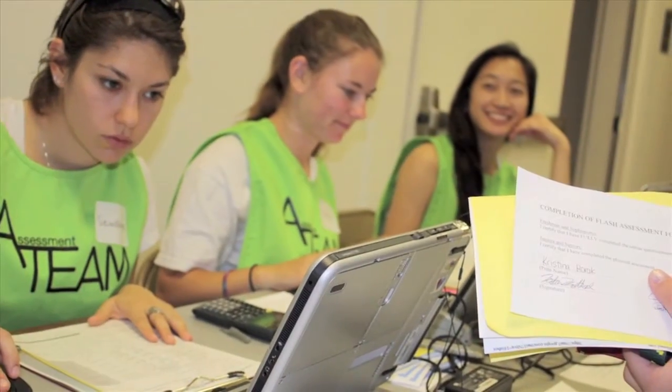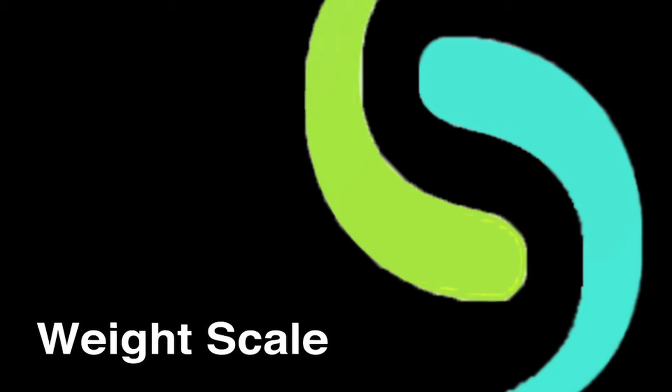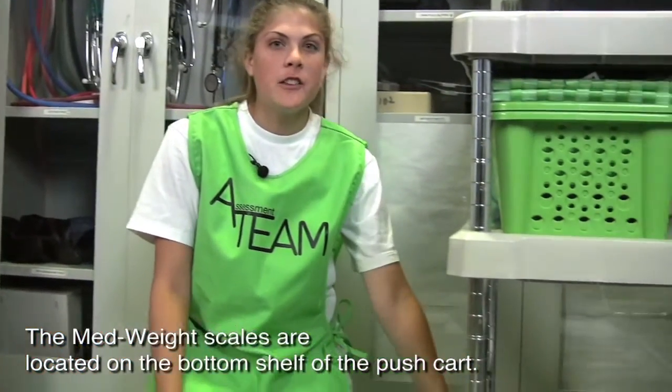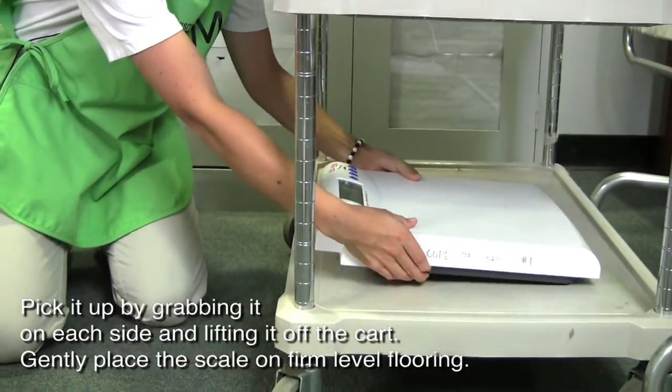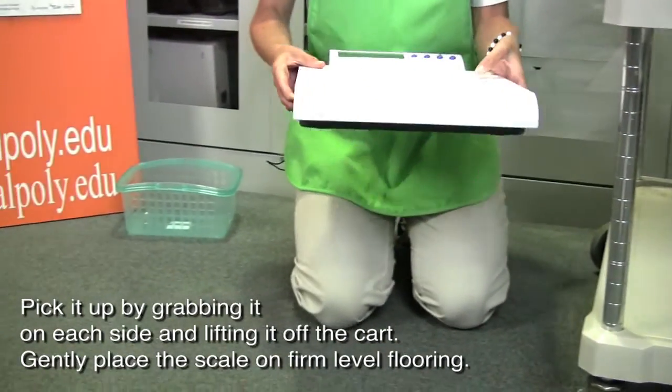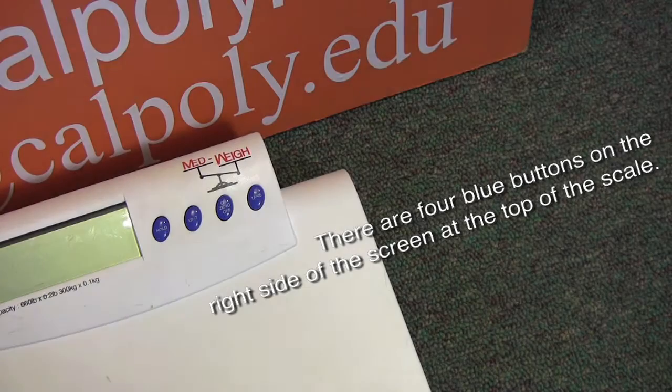Stride and Flash, creating healthy weight across the lifespan since 2008. The Med-Weigh scales are located on the bottom shelf of the push cart. Pick it up by grabbing on each side, lift it up and off the cart, and gently place the scale on firm level flooring.